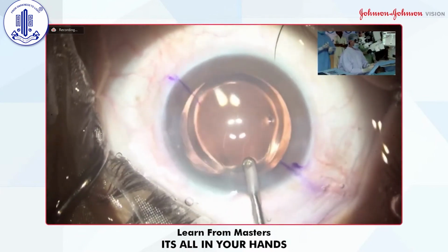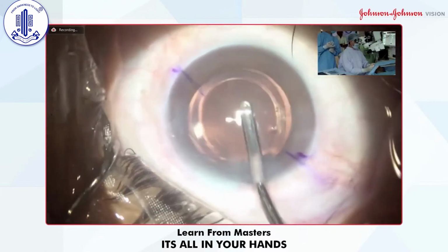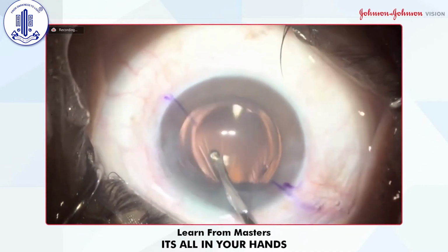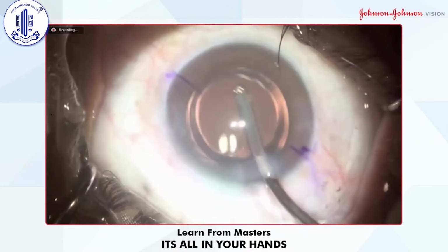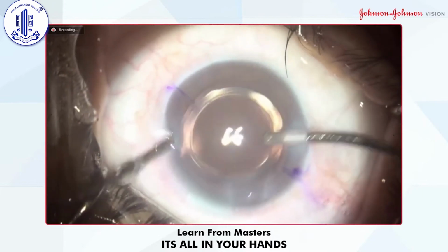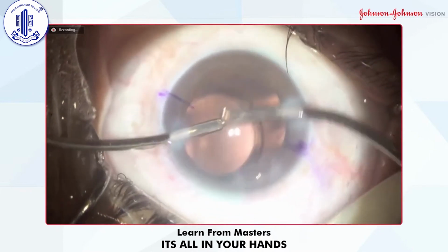So just press the posterior lip, give only irrigation because the binding of Helon and endothelium is so strong, you should not aspirate, you should not use the suction. Otherwise, it can take away the endothelium also. So making this removal of this visco behind the IOL.